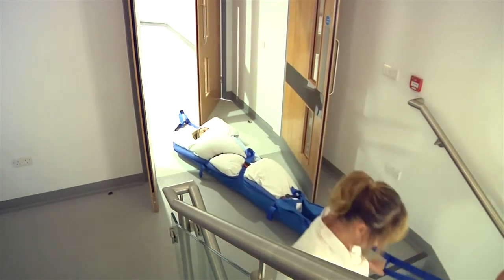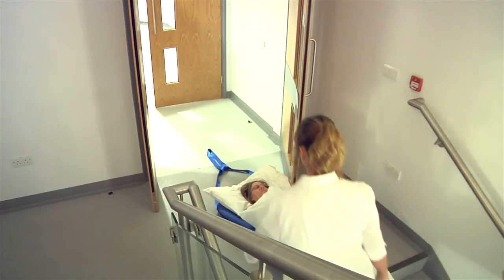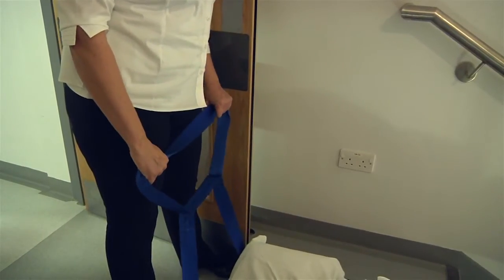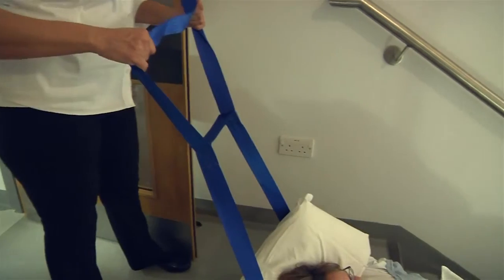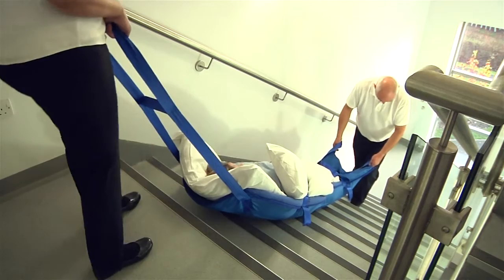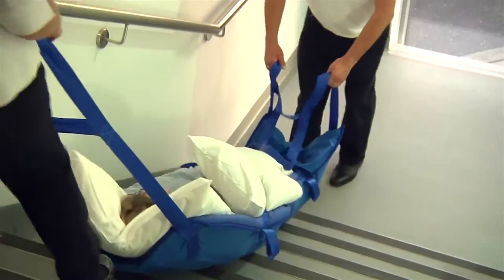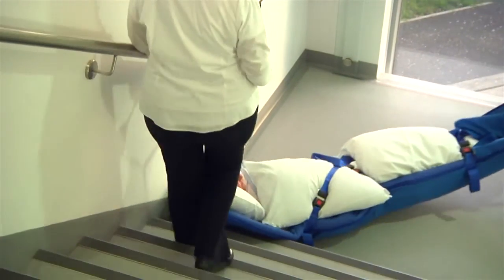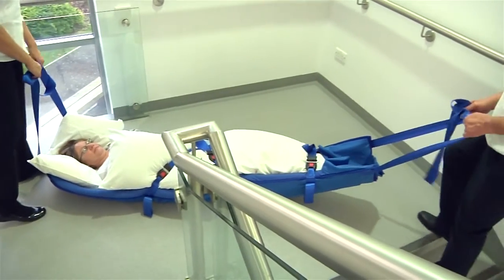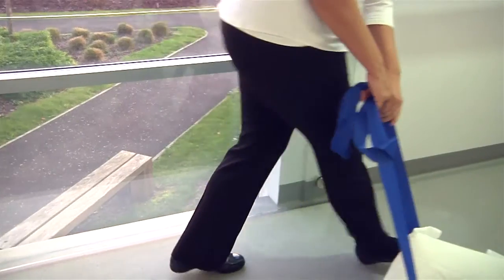With one person at each end of the ski sled, the patient can be negotiated down the stairs. The operator at the head end should keep the pulling strap long and assist by slightly raising the handle as the body moves over the top step. It is very important that the person at the foot end keeps the pulling strap short until the upper part of the body has come over the top step. This helps to prevent excessive bending of the patient's hip and pelvic area. When reaching the half landing, it is important to steer a wide course so you do not encounter problems with the central pillar of the staircase.